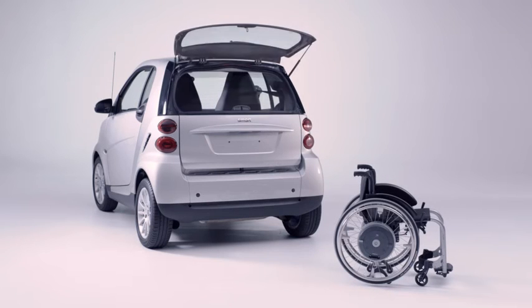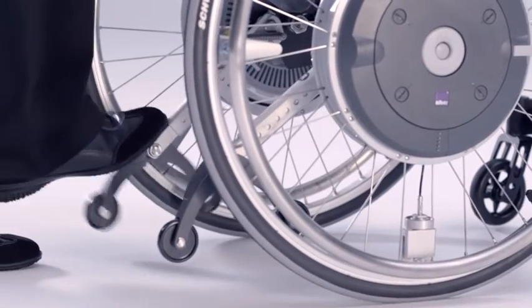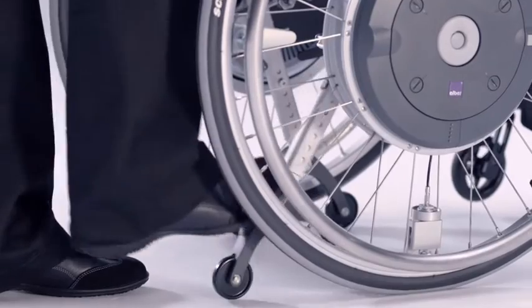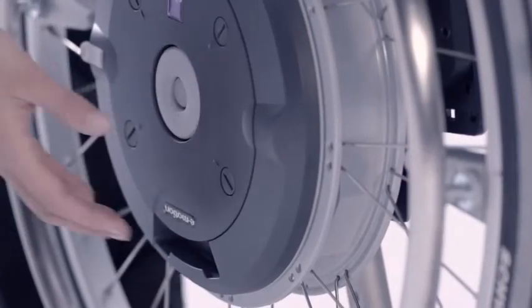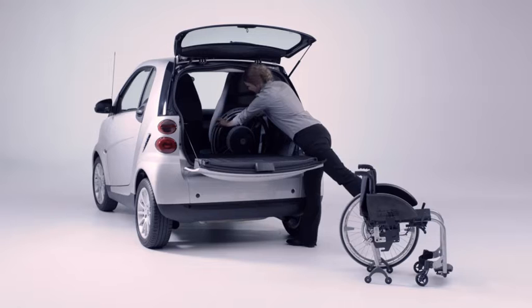eMotion is also an ideal travelling companion. The anti-tippers even have two functions — they prevent tipping and also make it easier for you to remove the wheels. The wheels are removed via a quick release axle, making them easy to transport in the car.